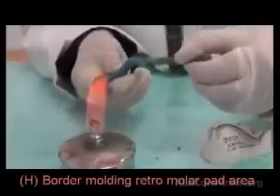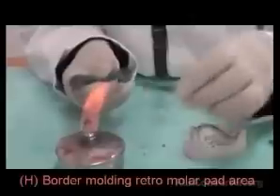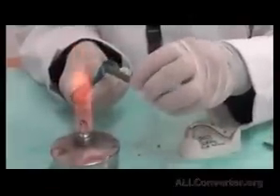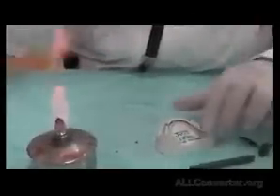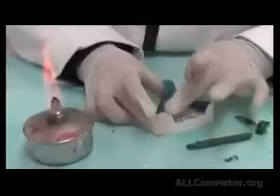So in the retromolar pad area, I add the green stick on the fitting surface together with the posterior area. Heat, give it a shine, cool it down a bit, go into the patient's mouth, and the instruction here is to open widely.